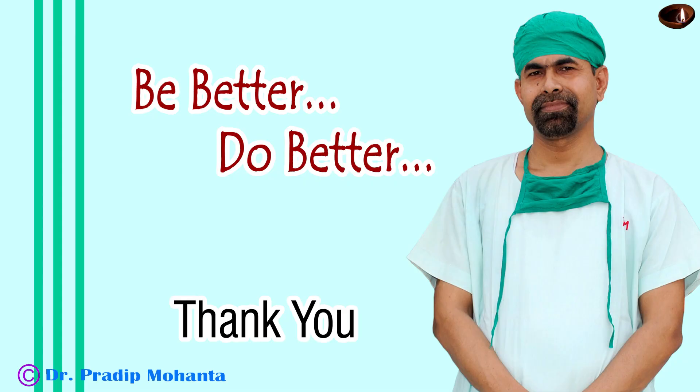Please learn how to use pre-chopper — your soft cataract management will be very easy. Thank you very much for your attention; hope this video will encourage you to use Mohanta's pre-chopper.